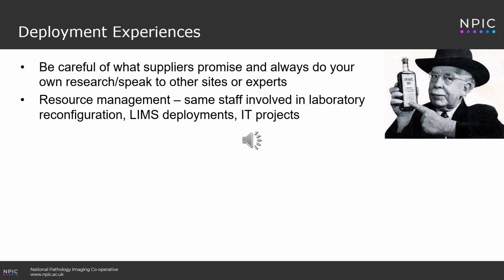That's not necessarily a bad thing, but it's just important to be clear about expectations. What you don't want to do is find that you think you've budgeted for all the necessary components, and then get a surprise 6 months down the line when you're not in a position to be able to scan everything that you thought you would.